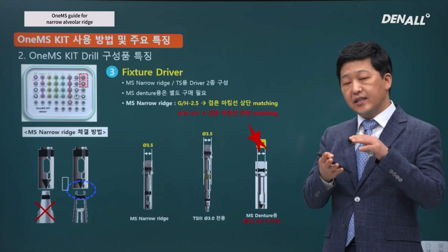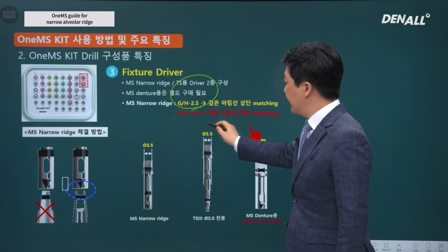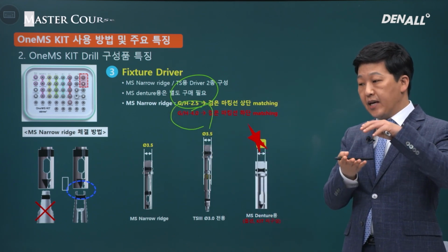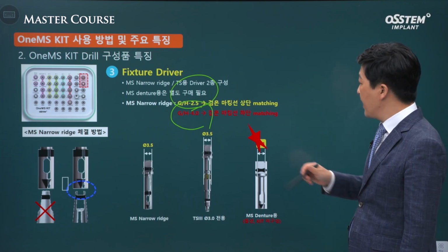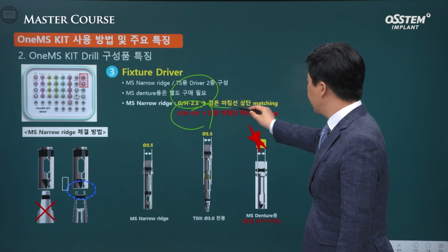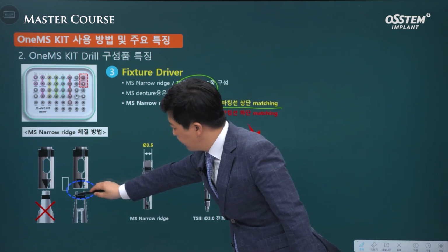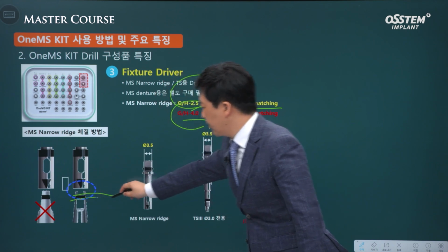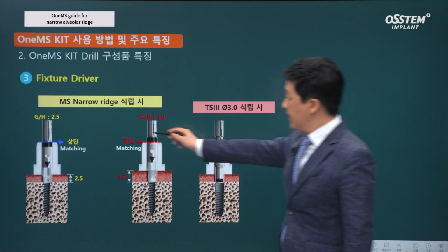As for MS implant, the gingival height is 2.5 and 4.0. Depending on peri-implant mucosa, you can choose accordingly. When placing implant with a gingival height of 2.5, you need to place the implant beyond the black line. When the gingival height is 4.0, you need to place the implant up to the point where it is just below the black line. That is the protocol.